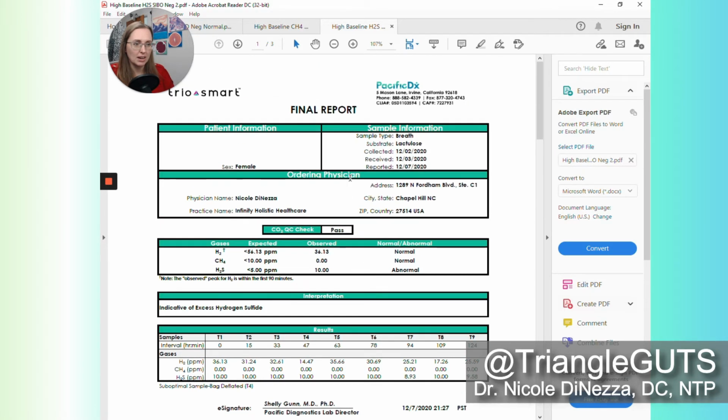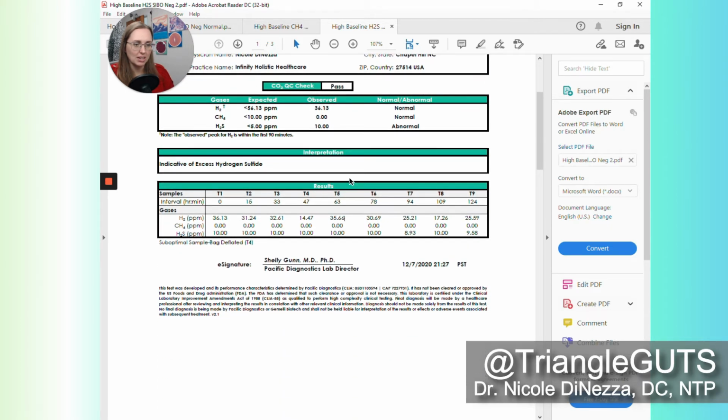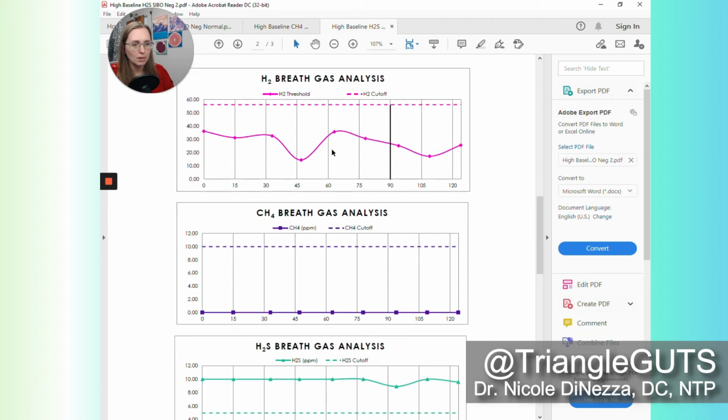And let's see what the date on this was. This was late 2020. I think that the lab was still kind of adjusting their ranges. If we use the more established 20 part per million range for hydrogen, then this would actually be barely positive for SIBO for hydrogen purposes. So that's worthy of knowing. For some reason, they had their cutoff way the heck up here. I don't know why. But you can see that we do get a peak, and there is a quantifiable number.